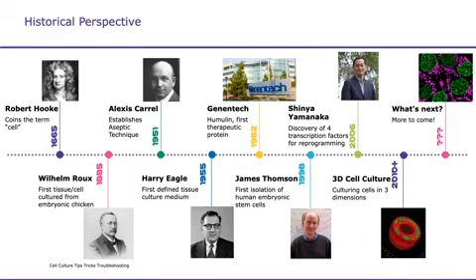Also, quite recently, you can consider it quite recent, around 2010, 3D cell cultures were brought into the world of cell culture. So what is next? There are probably some more things to come.